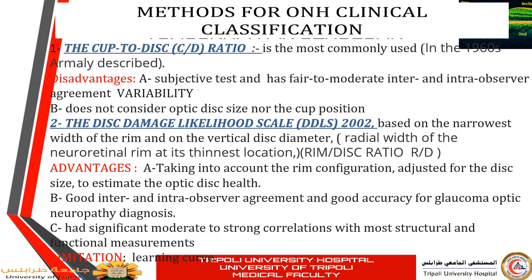vitreous detachment. Even the recommendation of the European Society of Glaucoma, the 5th edition, says that glaucoma cannot be diagnosed by the OCT alone. The imaging technique should be used as an adjunctive tool to the clinical examination. So examination of the optic nerve, and especially the optic disc, is mandatory as a tool in the diagnosis and follow-up of patients with glaucoma.